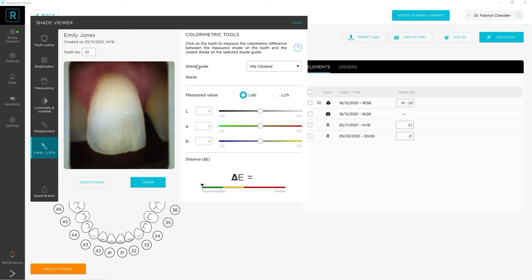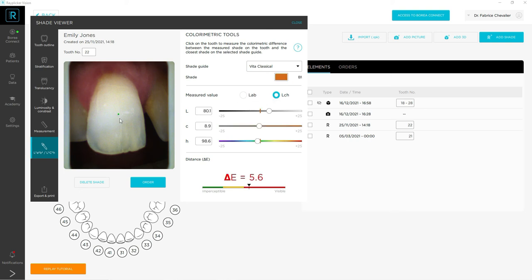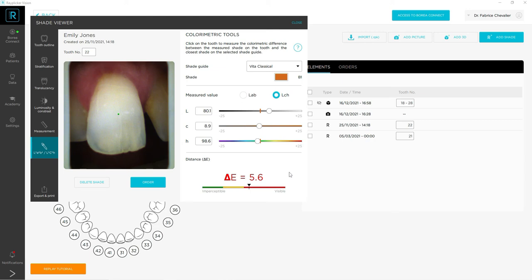And the colorimetric tools will help you to know in detail the LAB or the LCH values of a given point on the tooth. It gives you the delta E difference between the given value of the chosen shade guide, here is the VEDA classical, and the current value of the spectral data. The higher the delta E, the more visible it will be to the human eye.